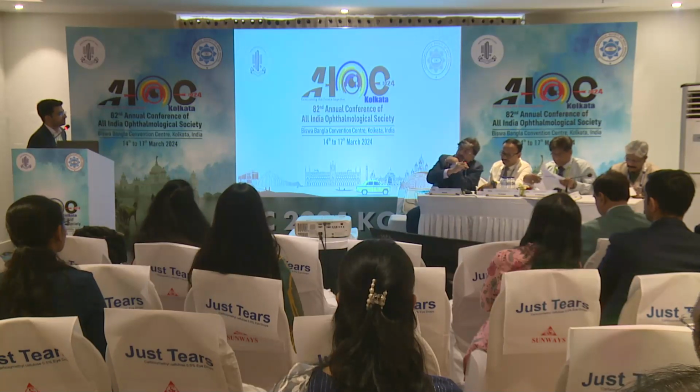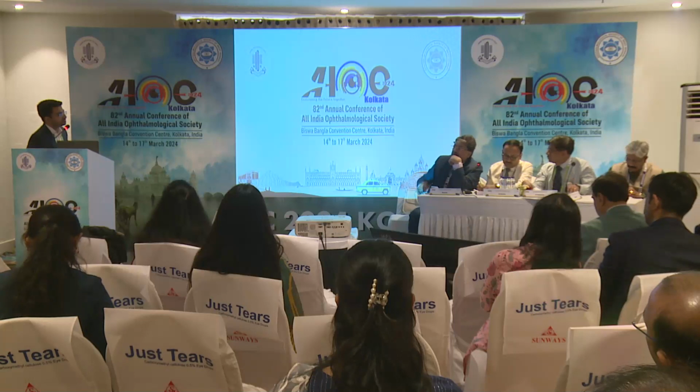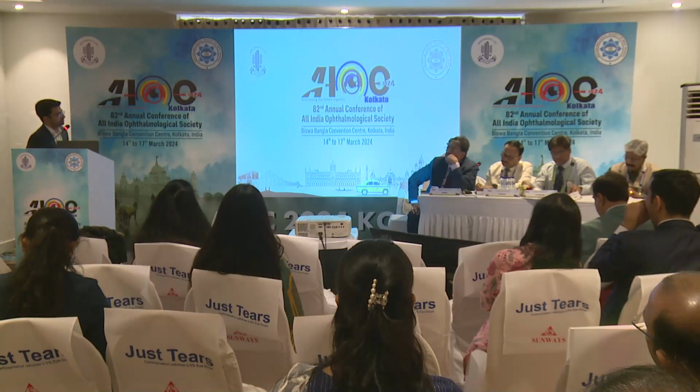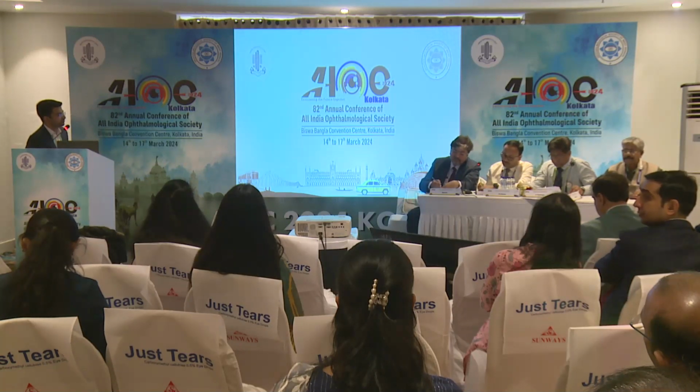And where was the IOL? In which location was the laser done? Laser was done where the haptic of the IOL was just touching. Was it a visually important area? It was in the periphery only, sir. That's why we didn't hesitate to laser also.